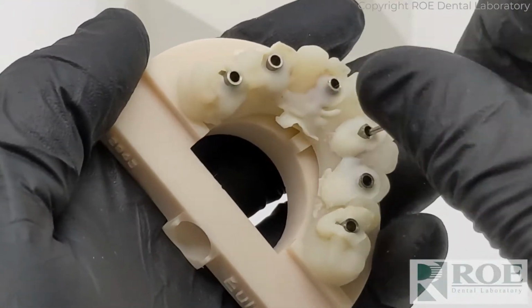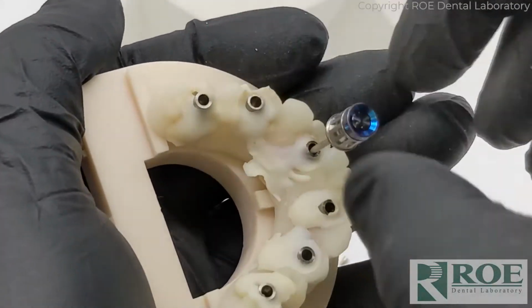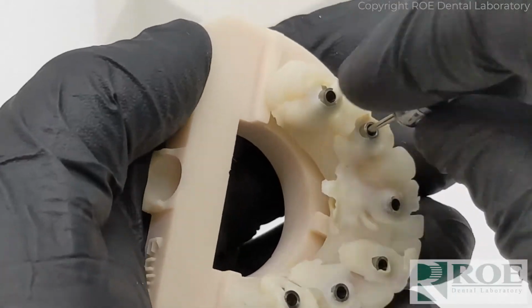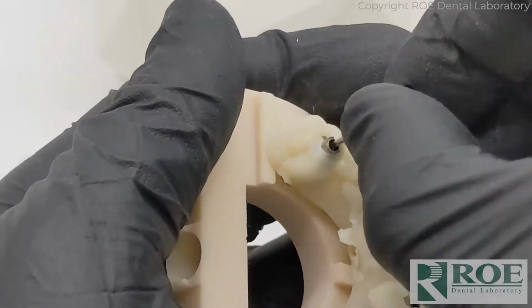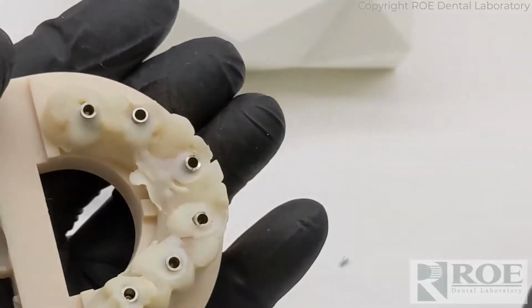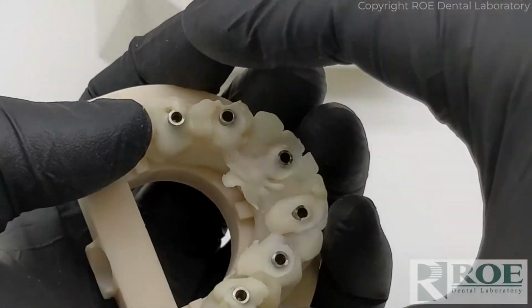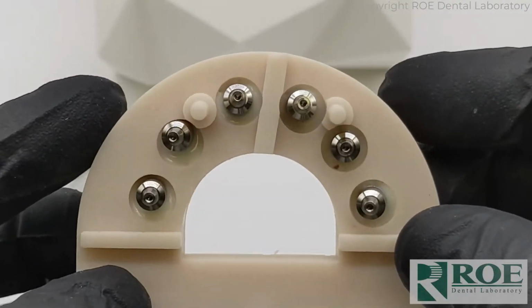It's always the trickiest thing in these surgeries to remember which screw you have taken or not taken out, even in the mouth. I go to a lot of surgeries and doctors perform these magnificent surgeries and then we just get stuck on the screws. Okay, and should be one more. Yep. Oh, I didn't loosen the first one all the way. I can feel it pivoting right here. Okay, screw. So this comes out, and now we have a model.